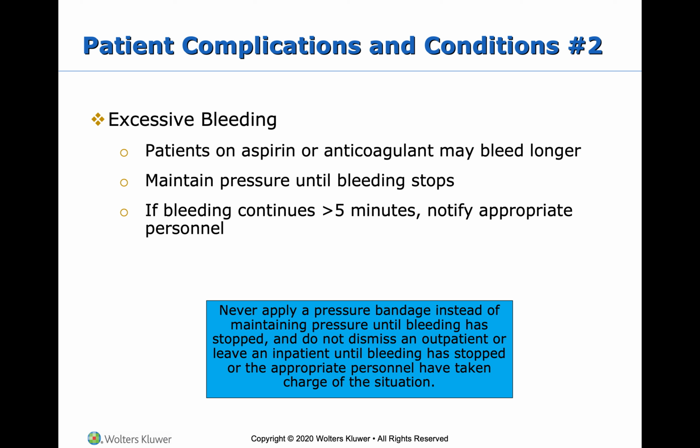Also, do not let them bend their arm up with the gauze. That's just asking for a hematoma as well. Always just keep the pressure on it. A lot of patients will try to put pressure on it themselves once you put the gauze on, and I usually just say, I got it, because I want to check and make sure that the bleeding is stopped. I want that to be in my control.